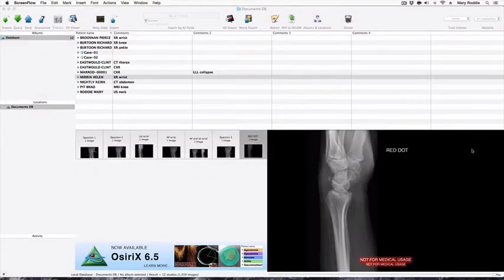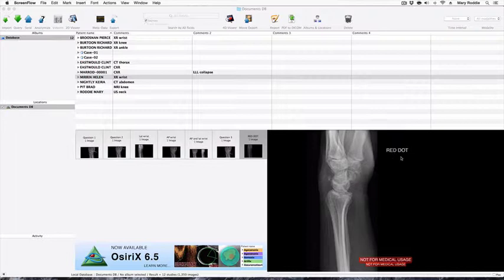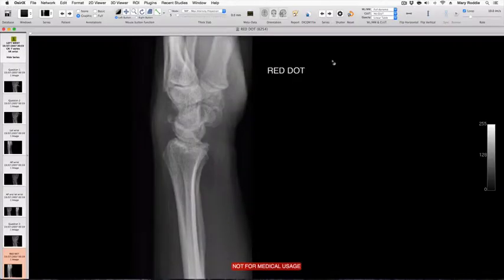The final topic we're going to cover in this tutorial is how to get rid of a particular area of text on an image, such as this case where this has been marked as a red dot case by the radiographer. This requires a slightly different approach.